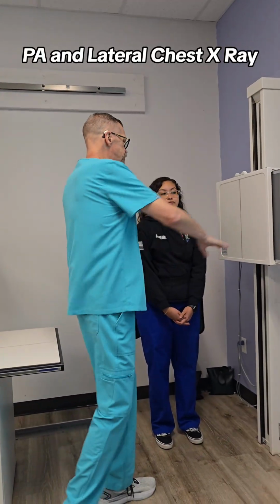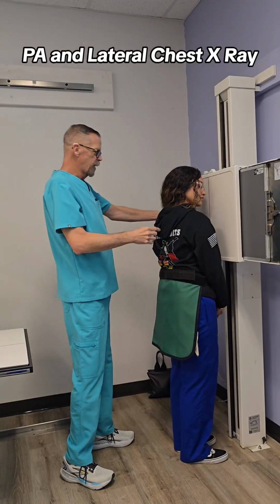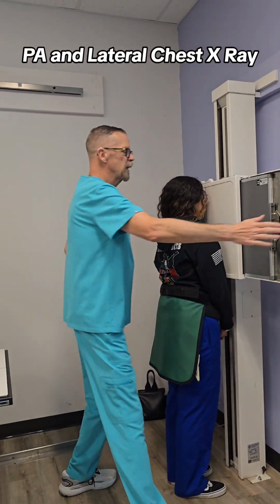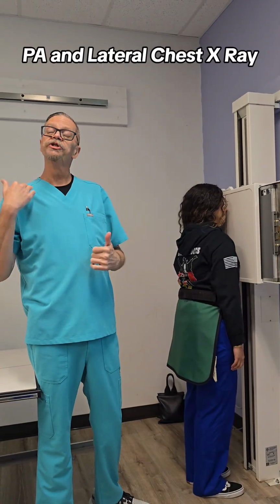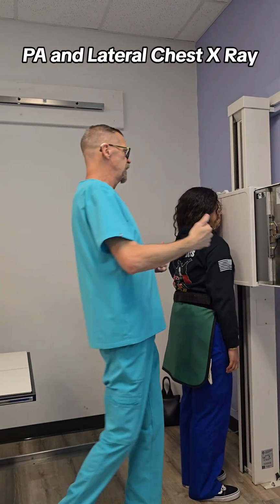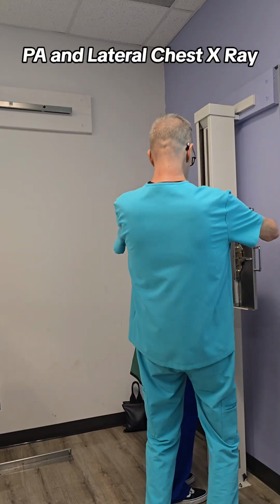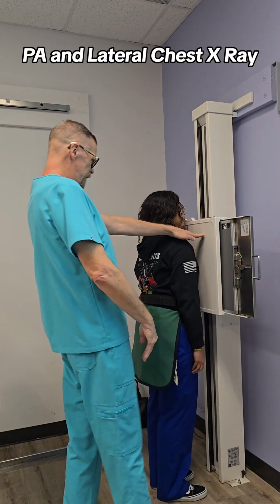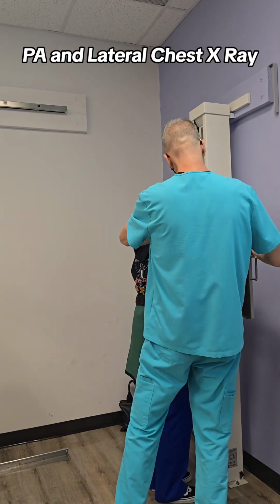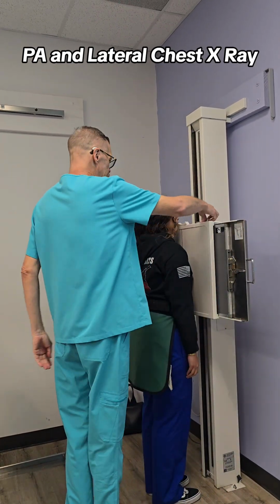All right, so I'm going to have you stand facing the image receptor. I'm going to move all your hair out of the way for a little bit. We want the top of the image receptor about 1.5 to 2 inches above the level of the shoulders. So obviously I'm too high here, so I'm going to lower it down. The way I do it is I put my hand right on top of the shoulder and guesstimate about 1.5 to 2 inches.